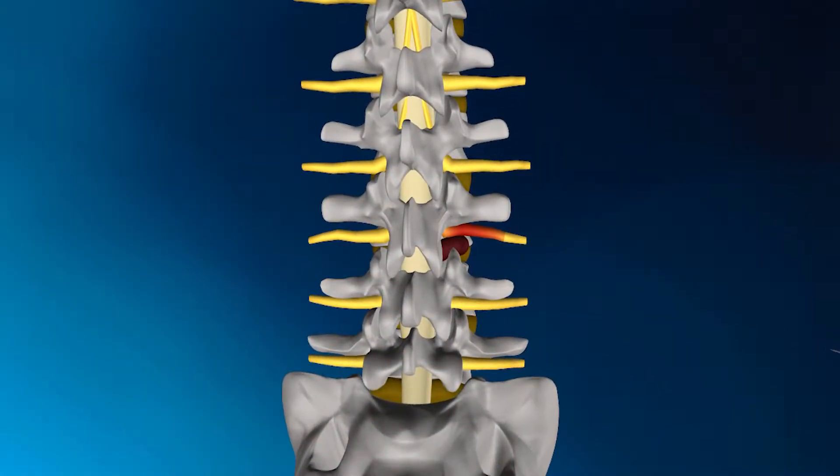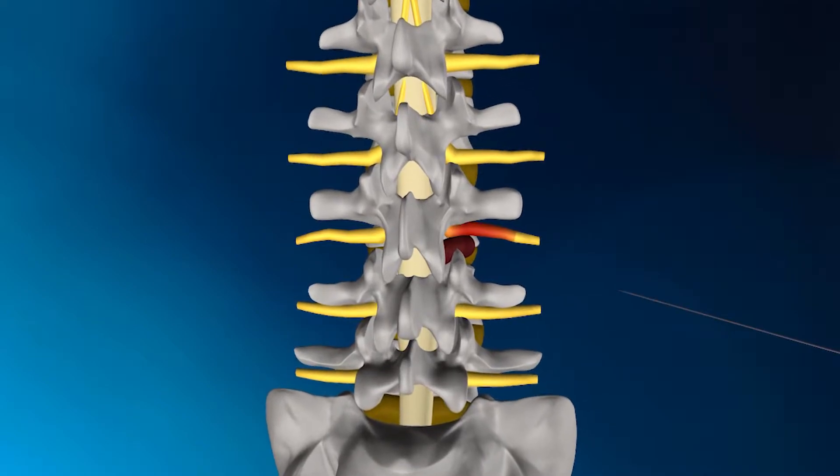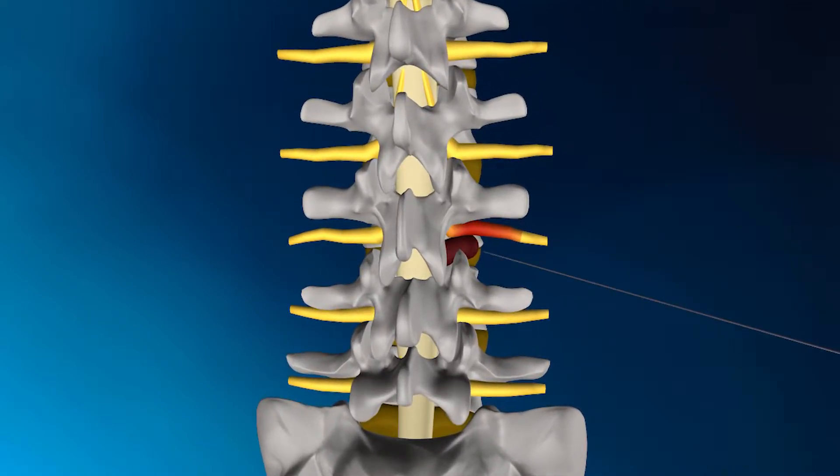The procedure begins by inserting a guide wire laterally towards the spine until it reaches the disc herniation. Then, a tissue-spreading dilator is placed over the guide wire and inserted down towards, but not into, the spine until it reaches the disc herniation.